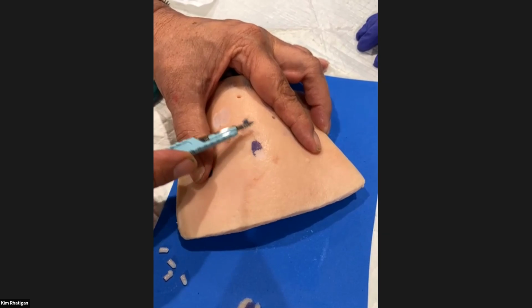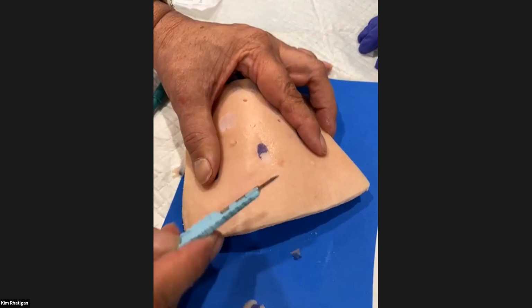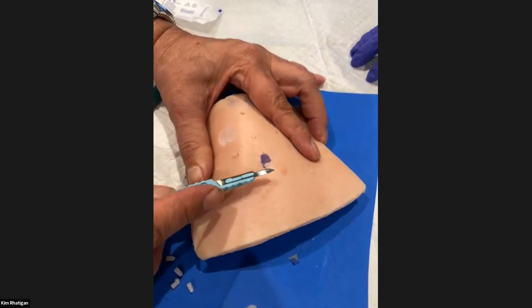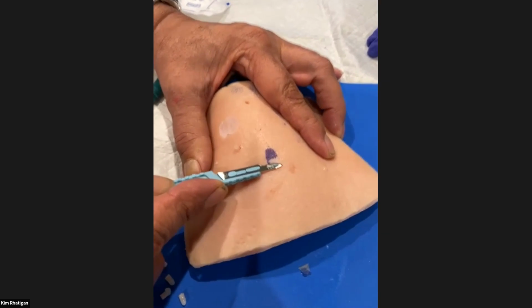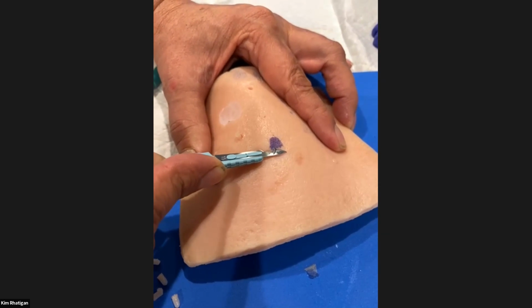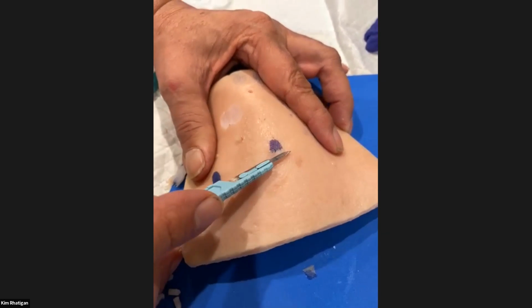Look at this. We're barely shaving it off. Now, if you did that, it would heal in a matter of 3 to 7 days, and you wouldn't even notice it. So that would be a partial shave. What is better for the pathologist is if you get the whole lesion. This number 15 blade is really small. I think we should use a larger blade next time. Okay, great suggestion.